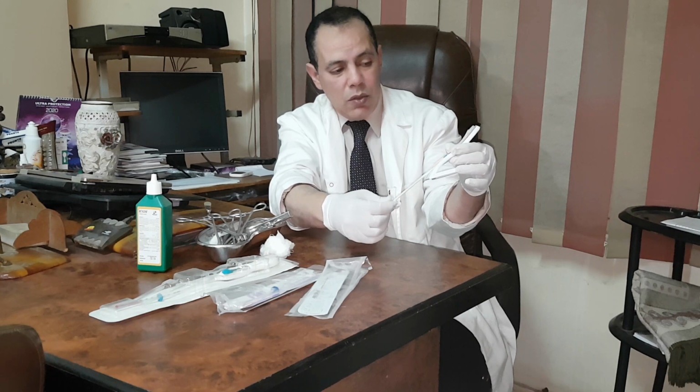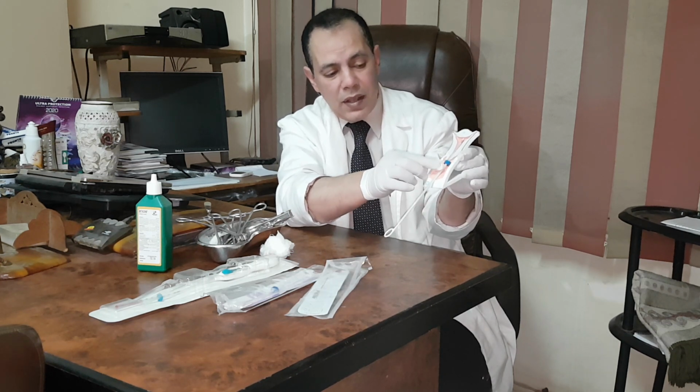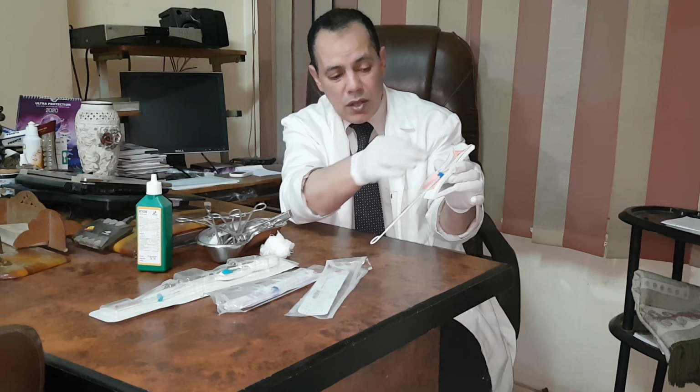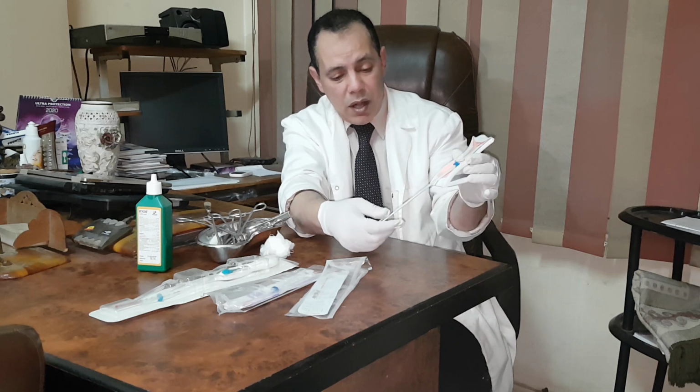Then, can you see the flange? The flange is at the portion at the external os. So I measure the length, I insert the sheath or the tube inside the uterine cavity.